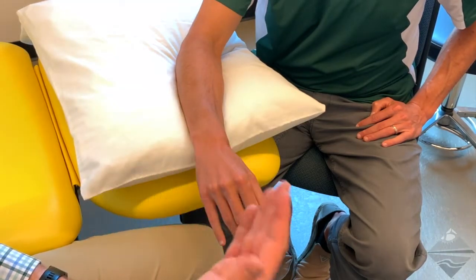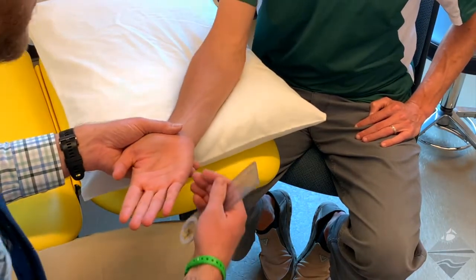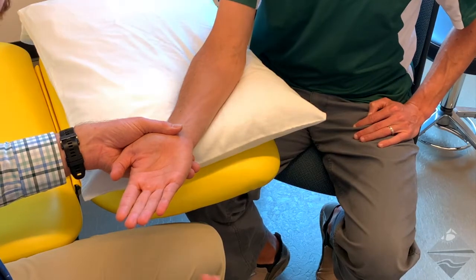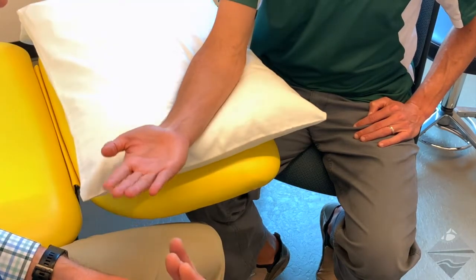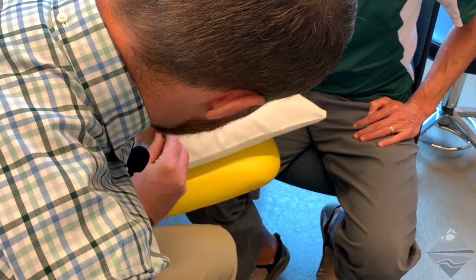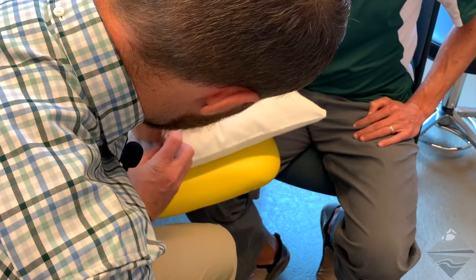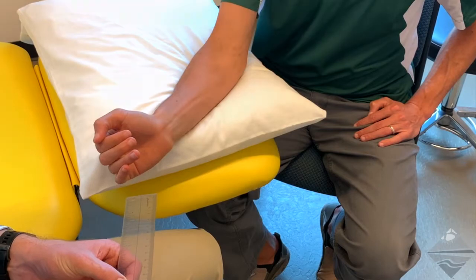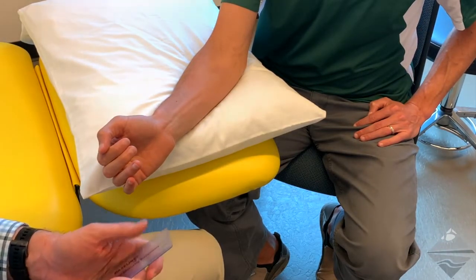For wrist flexion, we need to have the individual come into a palm up position. Again, we're going to stay along the lateral aspect — or in this case, the medial aspect — of the wrist and hand and have the individual flex. The axis of rotation is again the ulnar styloid process. We find the fifth metacarpal and take our measurement. In this case, the individual demonstrates 79 degrees of wrist flexion actively.